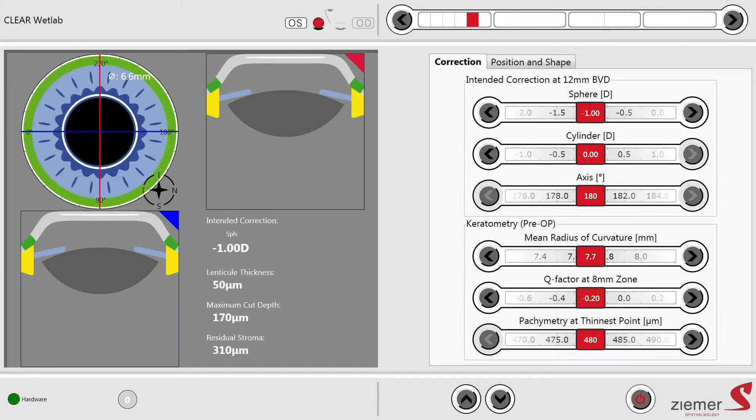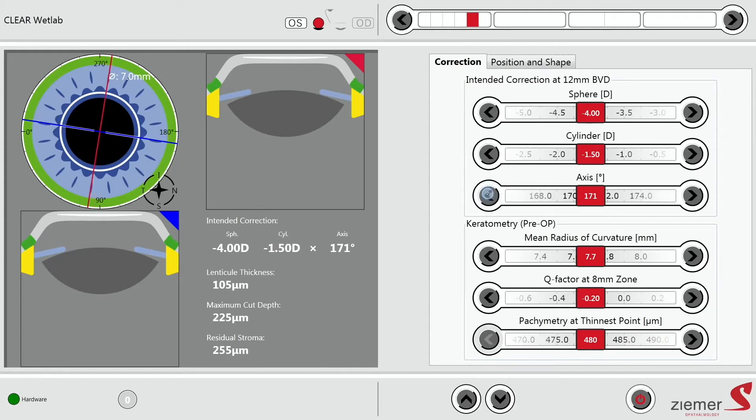I will now select the correction I want to apply on this eye. I will do a minus four diopter for the sphere correction and minus 1.5, for instance, as a cylinder correction. And then the axis also has to be changed to the one I need, which is here, for instance, 160 degrees.